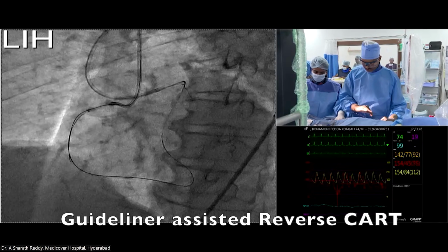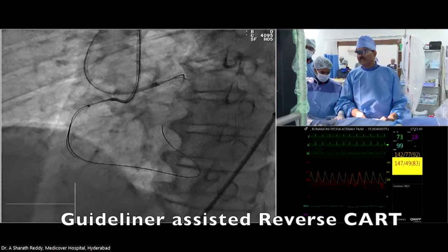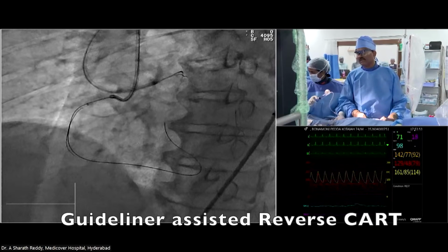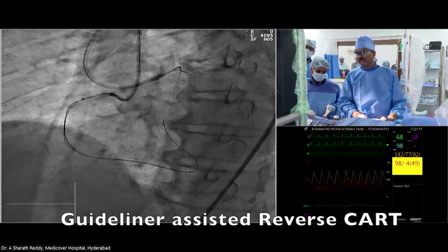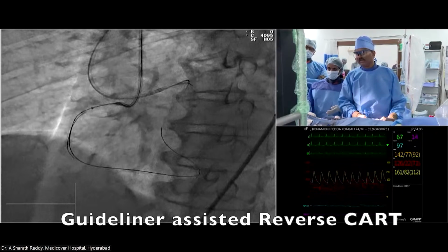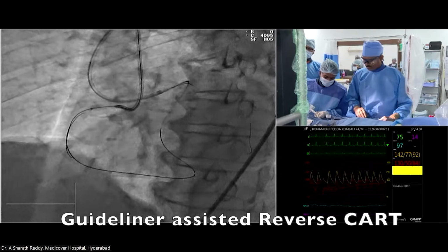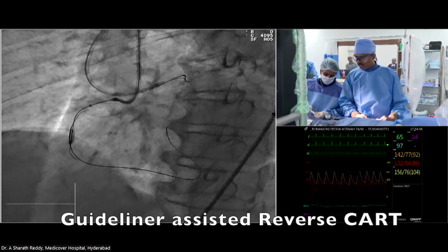We just dilated the entire lesion and then did an IVUS. IVUS is very important because we have to chart everything: where the wire is subintimal, where it is in the true lumen distally and proximally. Based on that, we'll decide the stenting strategy.